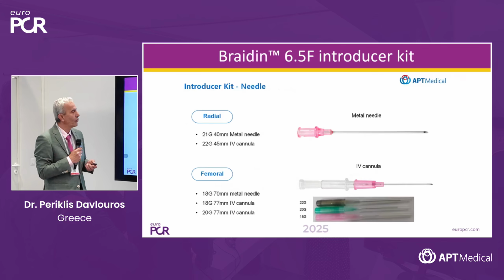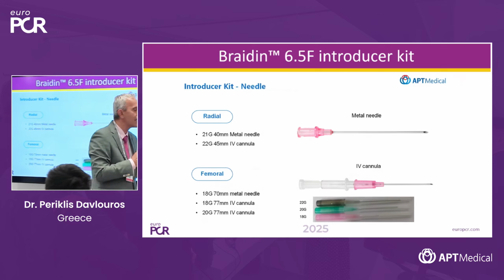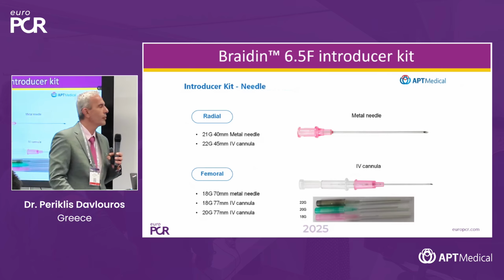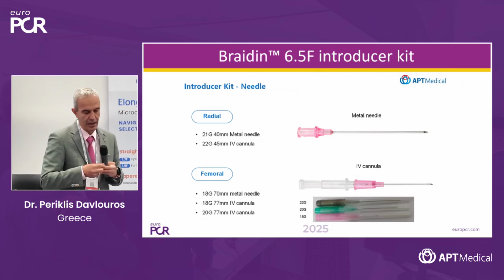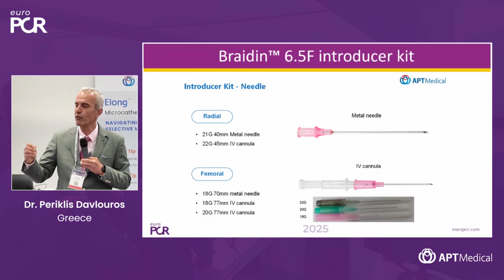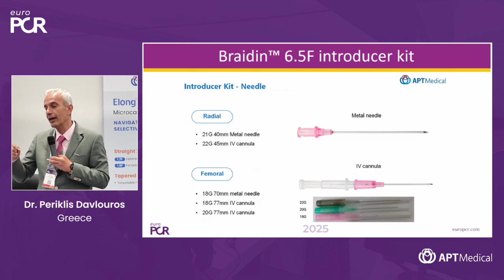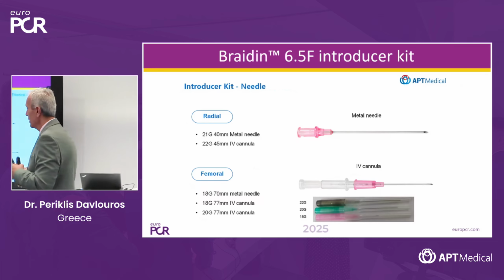and of course with a needle for the vein and a metal needle which was replaced, as I said in the beginning of this presentation. They were here, the needles. You have them somewhere to show to people that the new needle has a better grip, and it's very handy. It's also transparent, so you can see the blood coming out, and it's very, very handy and useful for the interventional cardiologist.